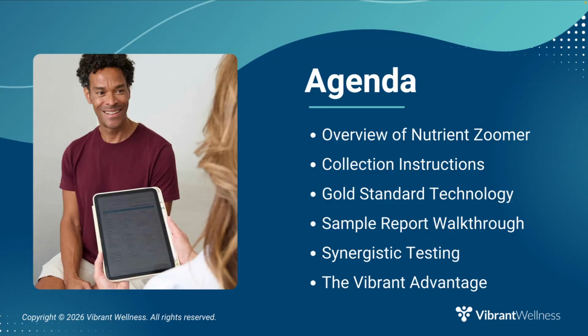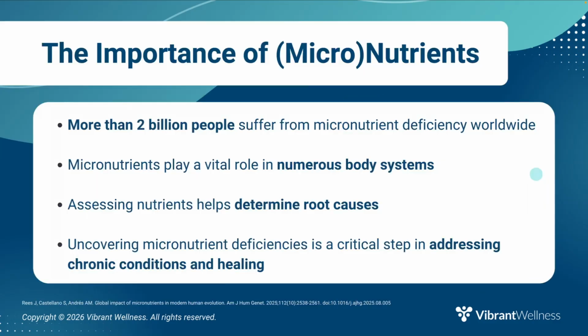During the test walkthrough, I'll also explain the technology used. We'll discuss factors that can influence nutrient status and why the date of service is critical to interpretation. Finally, I'll suggest synergistic tests and end by highlighting the Vibrant advantage and where to go for additional information.